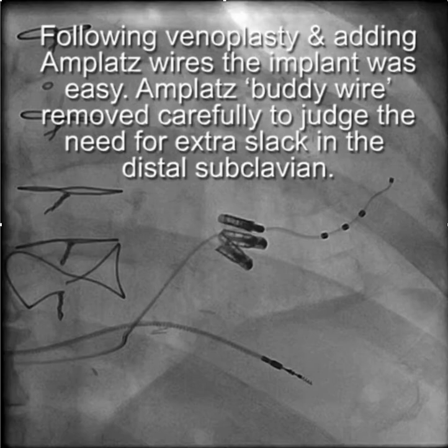This is just an example of how venous access can adversely affect lead placement and how you can overcome it.